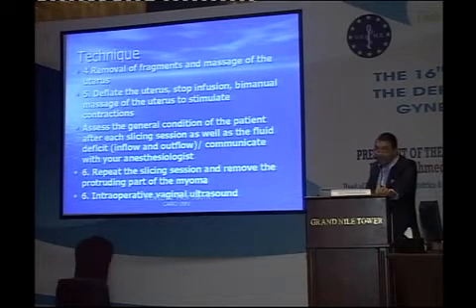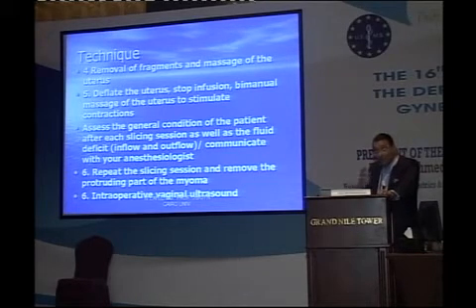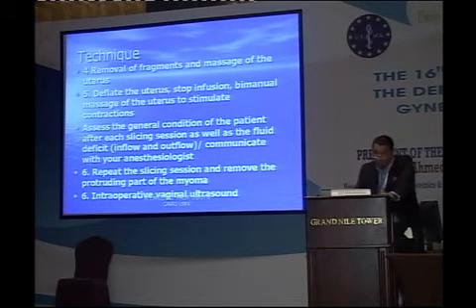After you finish with each session of the slicing, you will monitor the inflow and the outflow, and then you will assess the general condition of the patients. This is very important. So we never do more than a 10-minute session of slicing without stopping, reassessing the inflow and outflow and the general condition of the patient, communicating with your anesthesiologist, and making sure that the patient is in perfect condition. Then you start all over again, slice again the part that has been expelled within the uterine cavity. In this way, larger myomas within the wall can be removed with this technique.